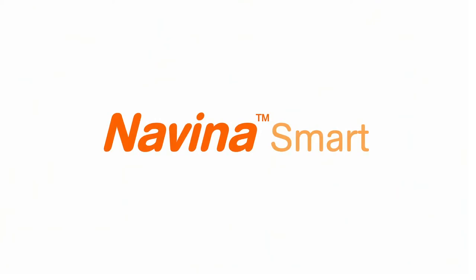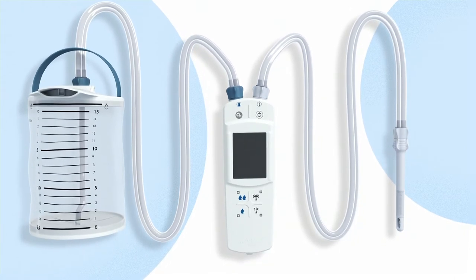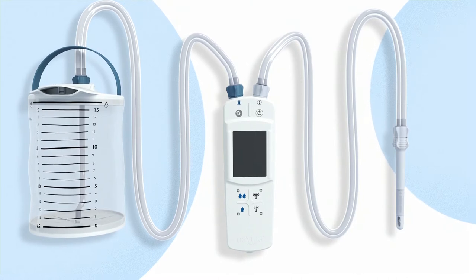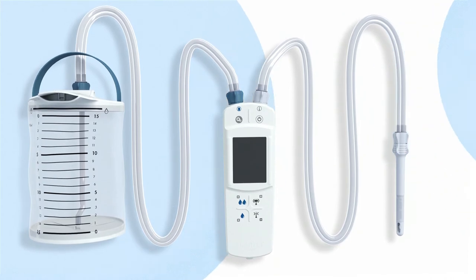Welcome! This animation will guide you step-by-step to transanal irrigation with Navina Smart. To get started with your Navina Smart, make sure you have everything you need: the water container, the control unit, the tube set, the rectal catheter, and any additional accessories depending on your preferred setup.